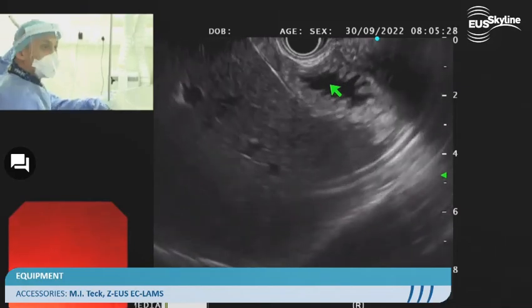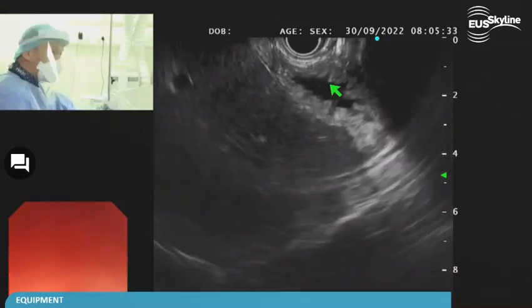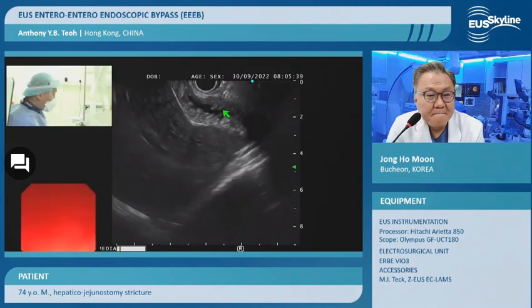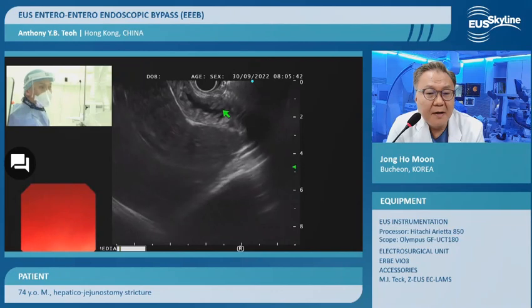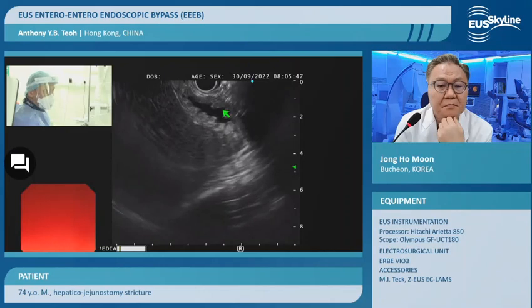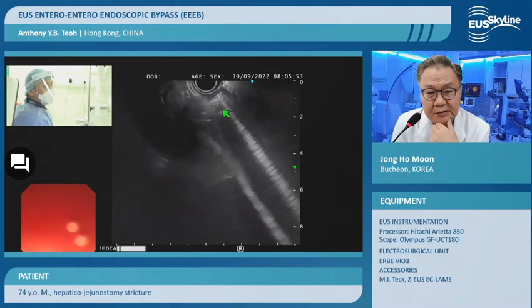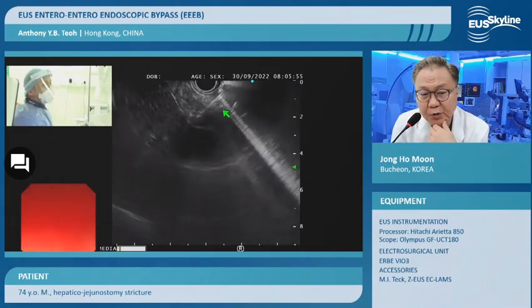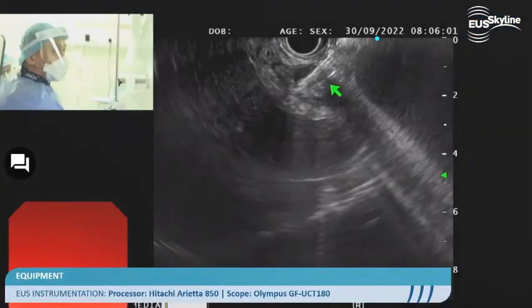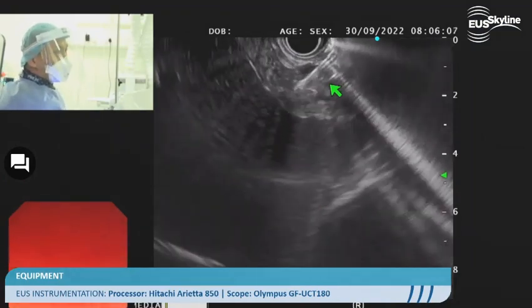A mixture of normal saline, contrast media, and methylene blue. How about the cc? How much is the amount? Well, actually, it's just arbitrary, by feel. So a bit of methylene blue and contrast so that you can see the limb. Okay, so I'm going to puncture now. Okay. Can we see fluoroscopy? Yeah. Okay, I think I'm not entirely in yet. Okay, yeah.